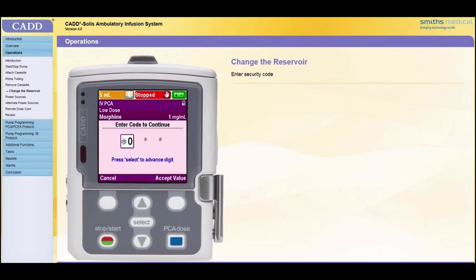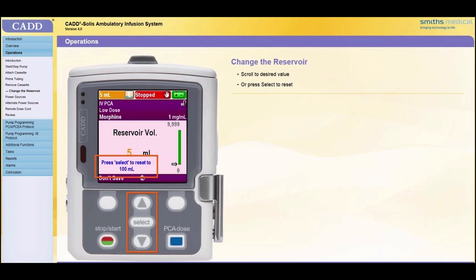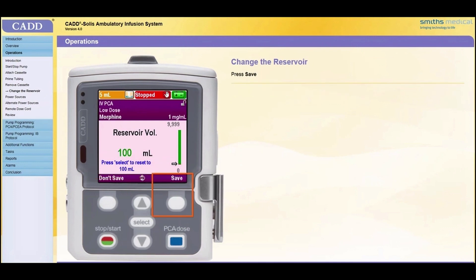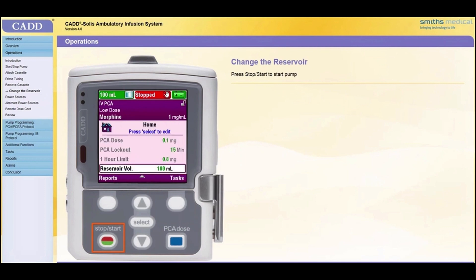Enter the security code as outlined in the overview module of this training. Scroll to the desired value or press Select to reset the reservoir volume to the value displayed in blue font. Press Save. Press the Stop Start key to restart the pump.